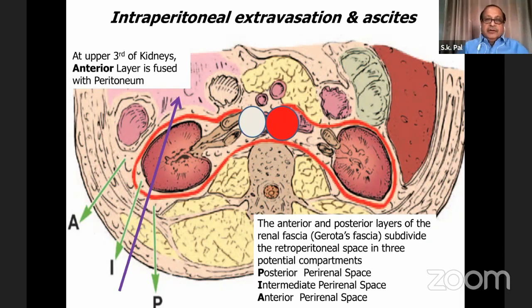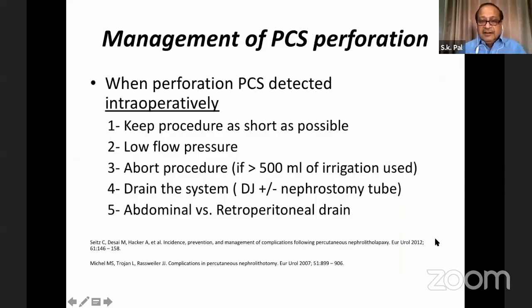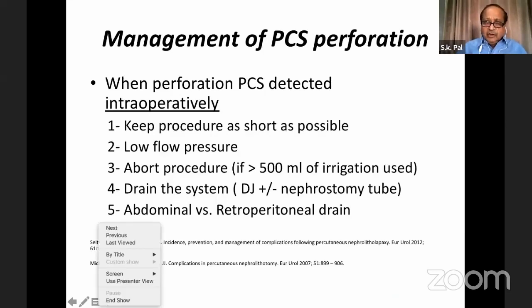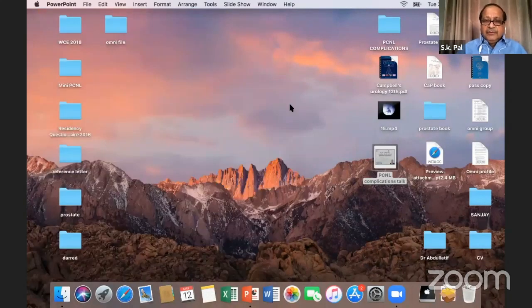And you have given a very right message. You can now stop your screen sharing. And the message is very clear. We have to be very, very, very careful. Under dilatation or remaining superficial is still much better. You can redo it. If you are lost, leave a tube, come out. Next time when you go in, the tissues will be well organized, and you will see it will be very smooth sailing.